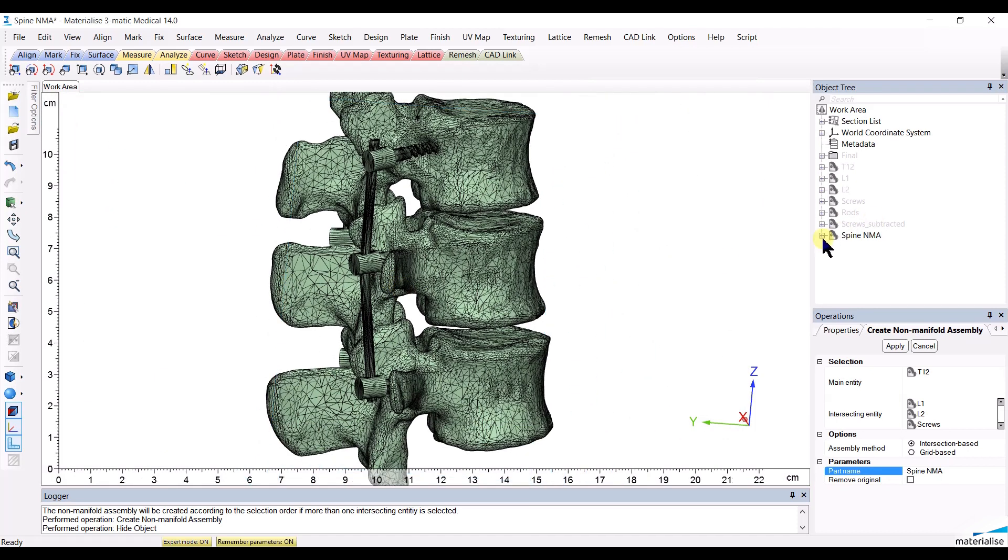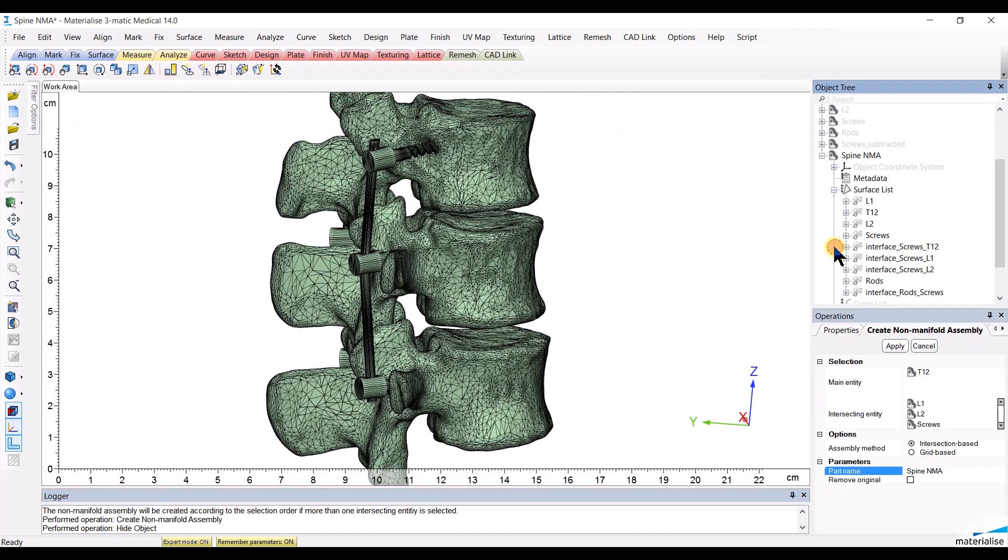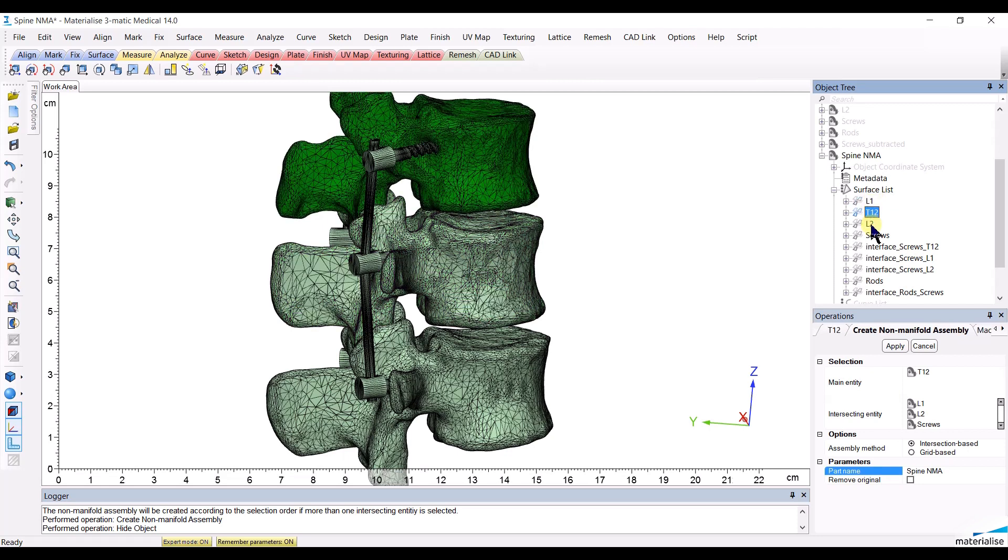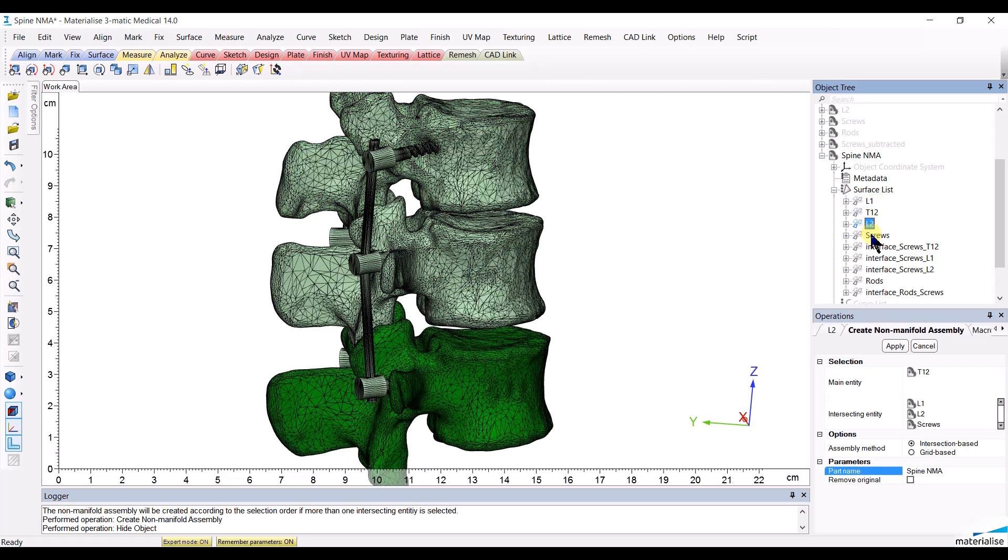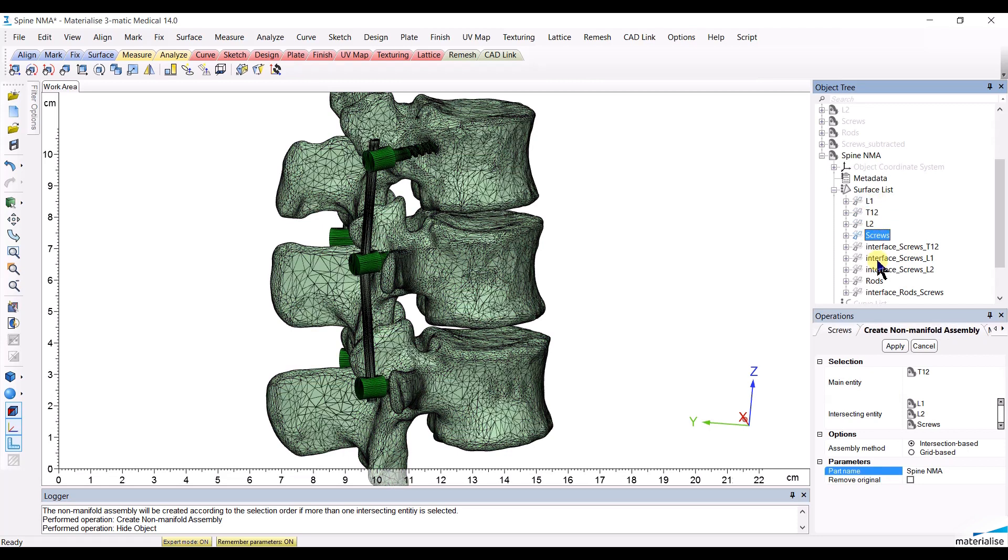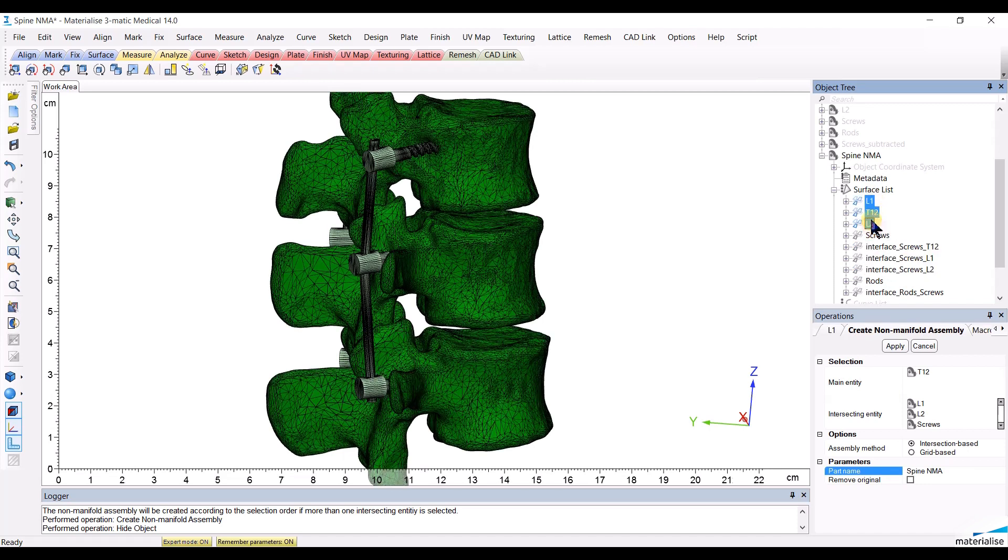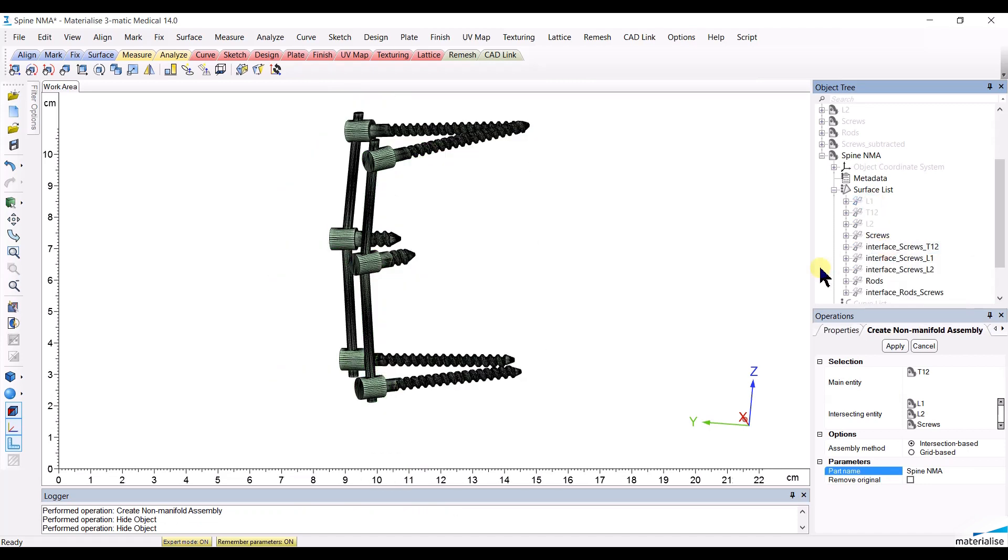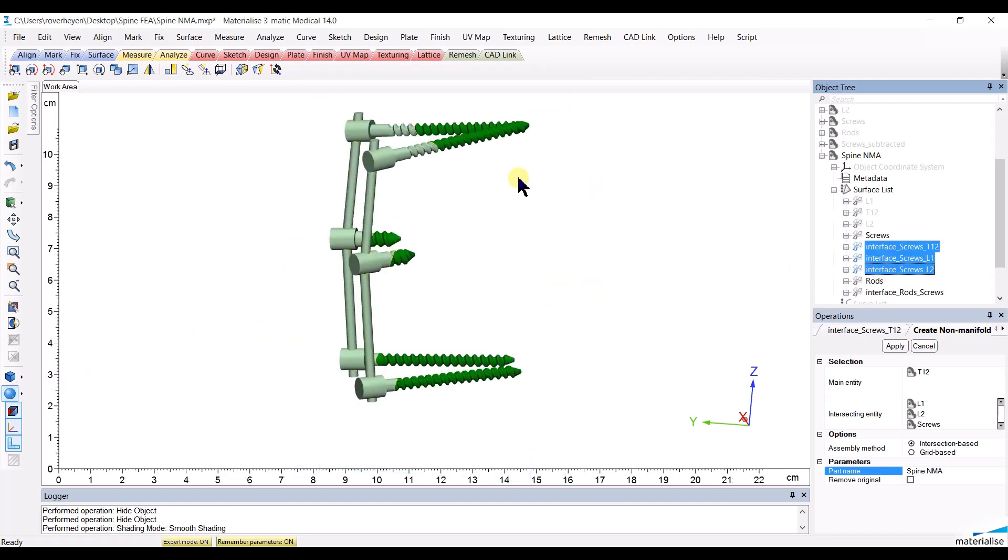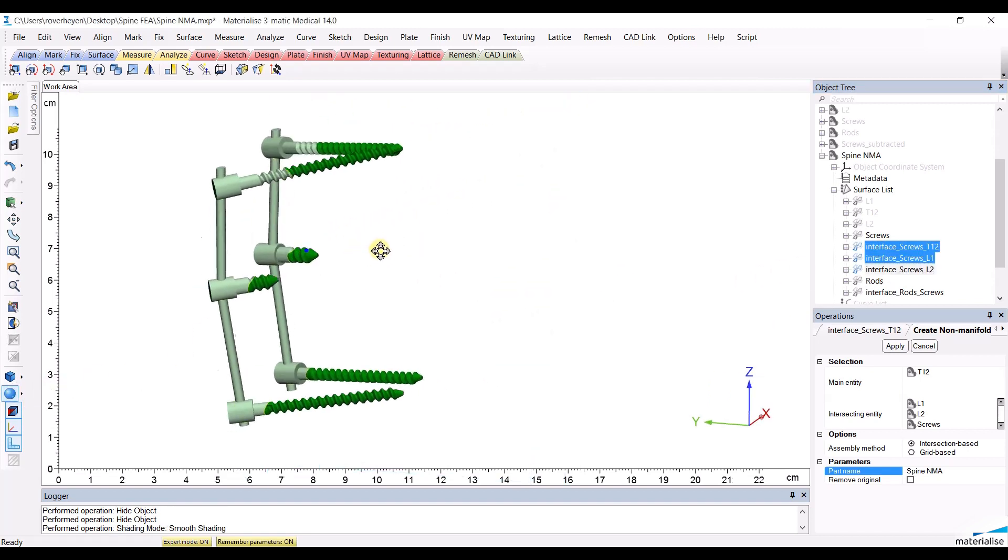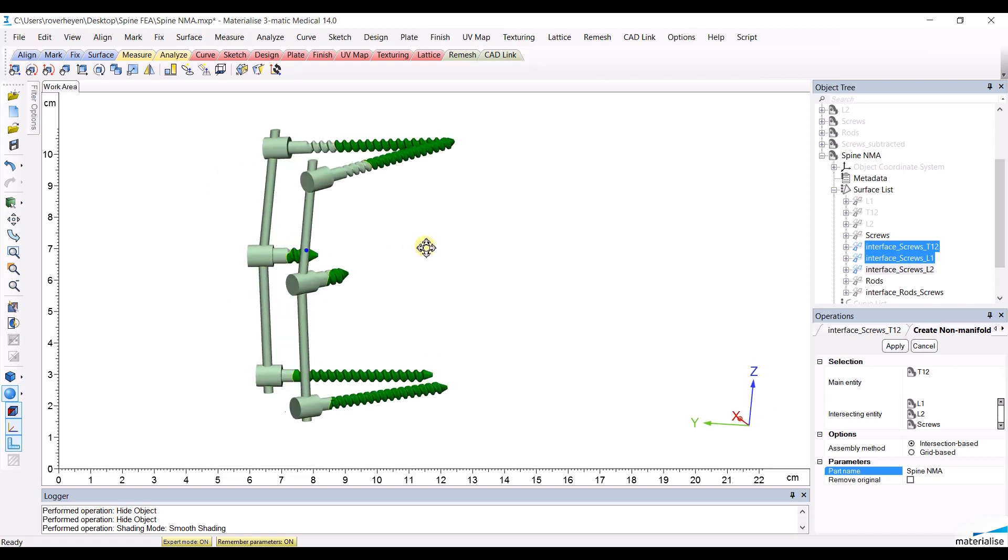Now, if we look inside the non-manifold assembly, we will see in the surface list that we can get back to a surface for each and every one of the original objects, as well as a different surface for each one of the interfaces. So, let's for example hide the vertebrae. We can see the interfaces of the screws with the vertebrae.